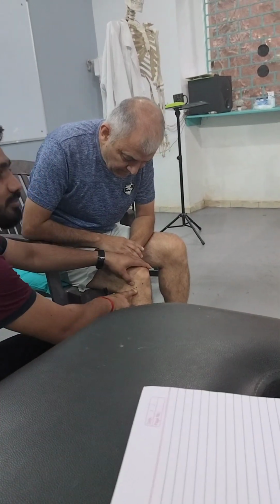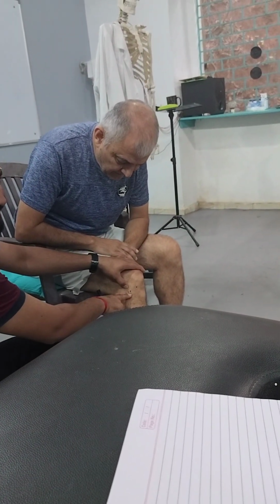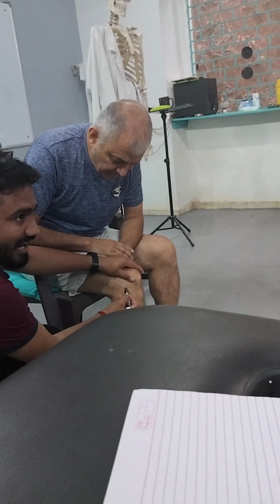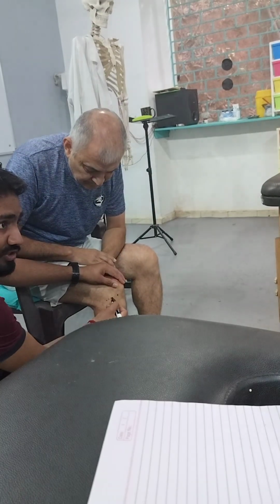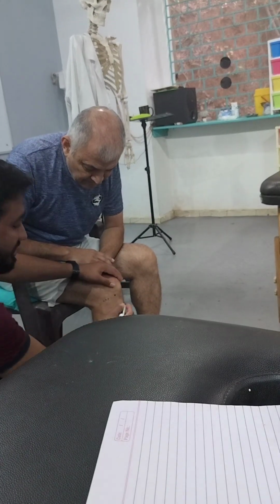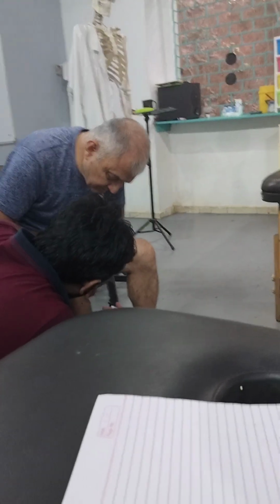This is the lateral side of the meniscus tear. Got it? Can you see this one on the side, on the same line of the knee? These three needles are for your meniscus, exactly on the same knee here.